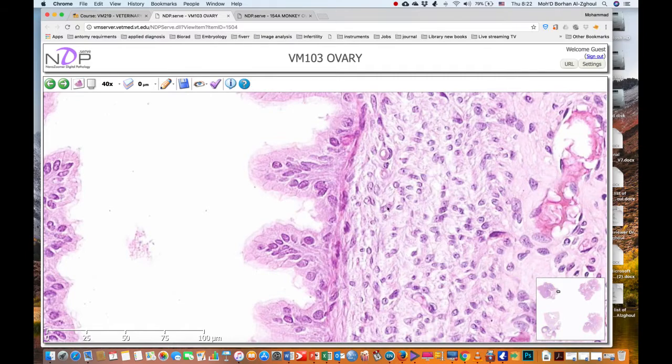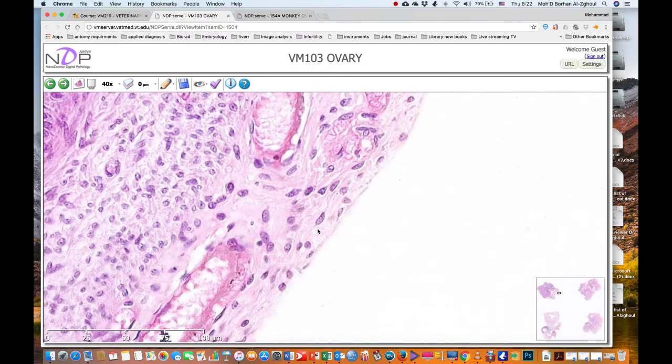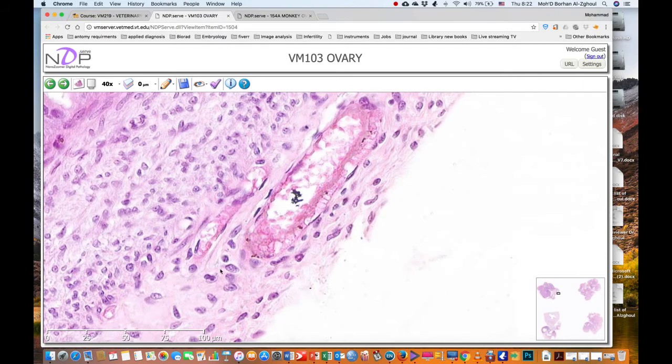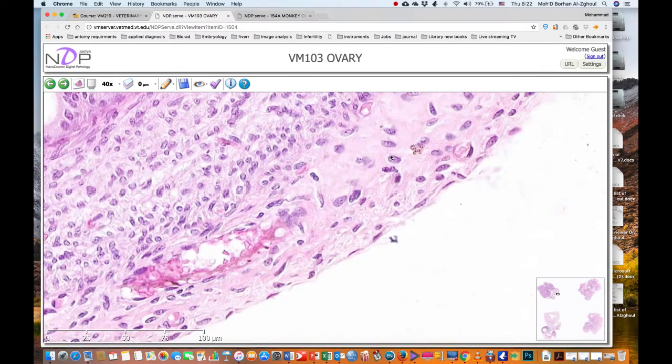We have here the lamina propria, and we should find a very thin layer with the smooth muscles. You can see it here. Whereas when we go to the area of the ampulla and the isthmus, there's a thickening of this layer, the layer of the smooth muscle. And outside we can see the serosa.